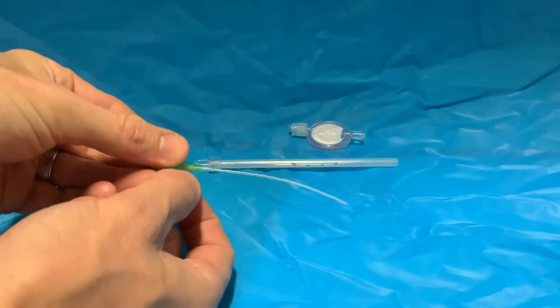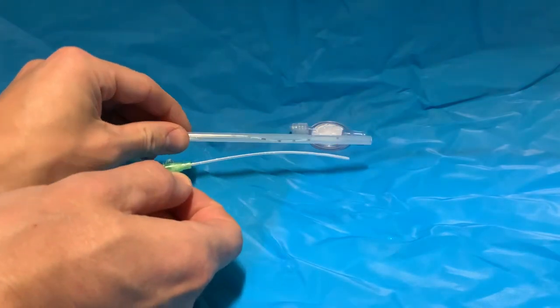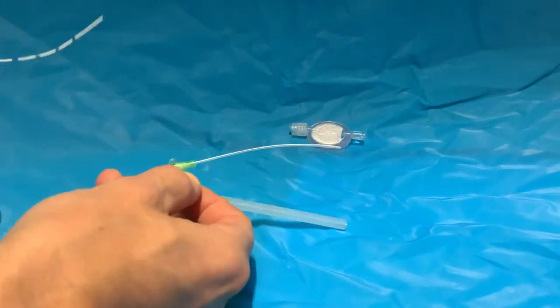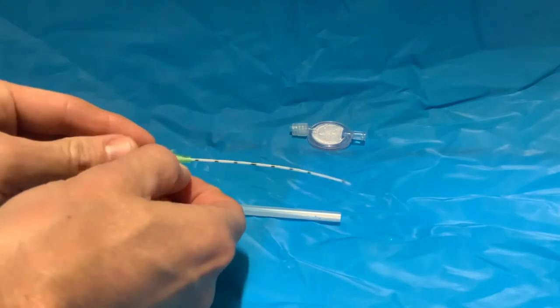At that point, you must insert the catheter through the cannula. It is exactly the same length and it will come just to the tip of the cannula.